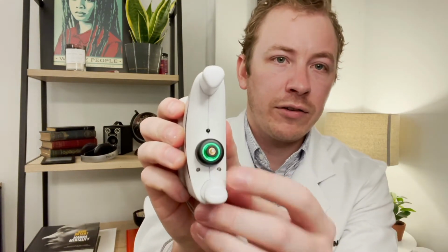So I'll cover the eye again, and I'll reset it because we had an error. And I'm going to place this on my forehead and my cheek, get it so I can see the full green circle. Hold it down. And 1 beep means it's done. Good capture. Done right there. When I want to switch to the other side, I just click this button. Again, no inputs for right eye or left eye. As the sensor's right here, it detects the nose on either side, so it can just tell for you.